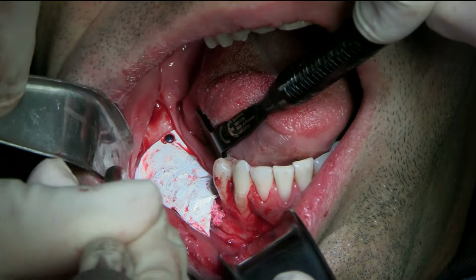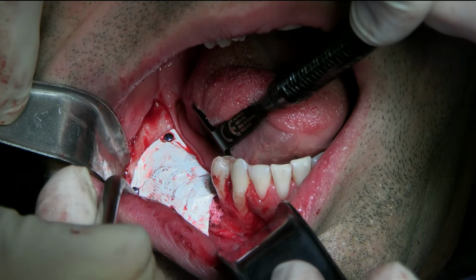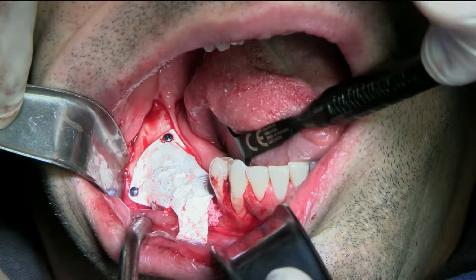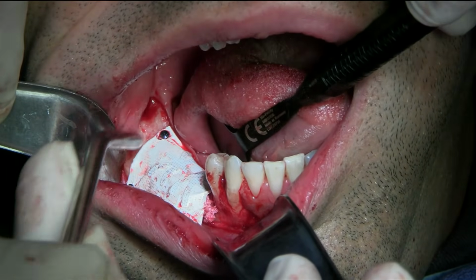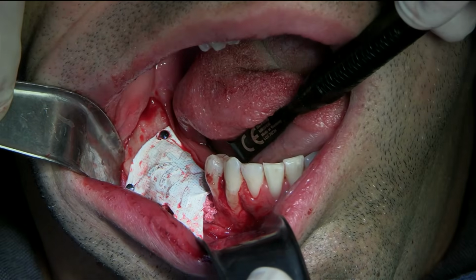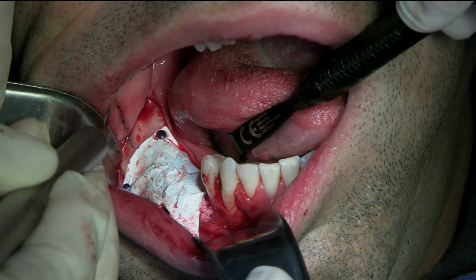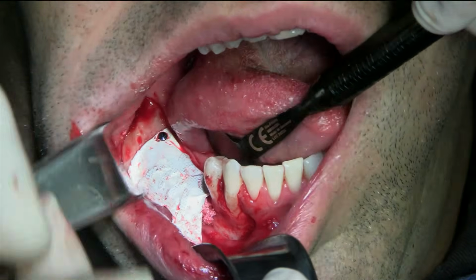Okay. Another. Can you see the second tack there? So that's the advantage of having a lot of PTFE, because I can move that membrane all the way down. It's nicely sealed, no space. Give me a periodontal probe. You can see that's a nice seal. The width. Now we have to do the anterior.